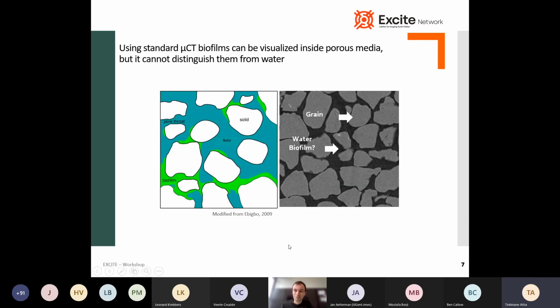So if you have bacteria which are growing in between sand grains, for example, which are here in green, you can see the water, you can see the sand grains. If you would make a micro-CT image from that, well, you will almost see nothing. You will see the grains and you will see a phase in between, which is water and biofilm, but it's impossible to see the difference between the two.